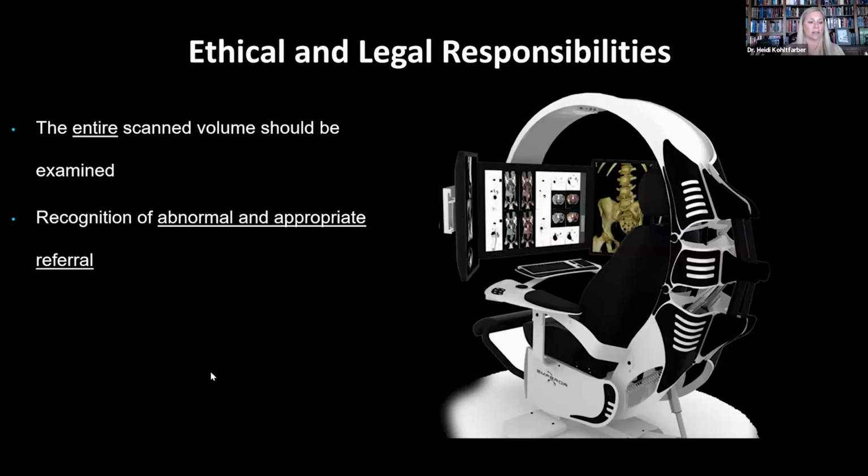That's the whole reason that many of us go into this profession, wanting to help people. You can really help your patients in a very big way with your CBCTs. It really shows you more moving towards that whole patient care, because the things that happen in the oral cavity are really representative of that patient as a whole. And so when you think about it as more of a holistic treatment, the window to that patient's health is really through their oral cavity.